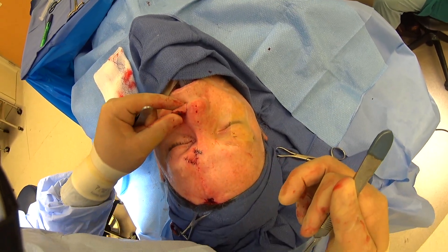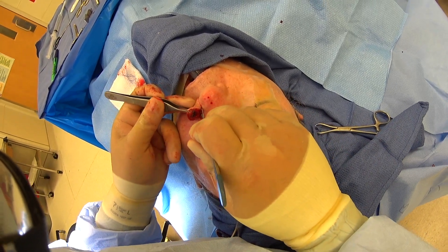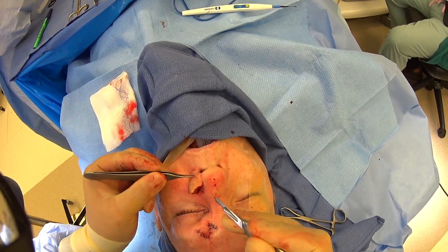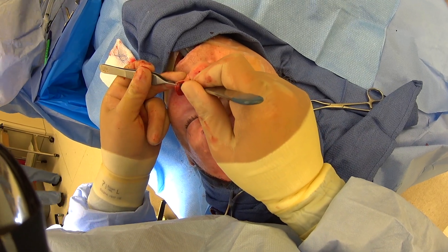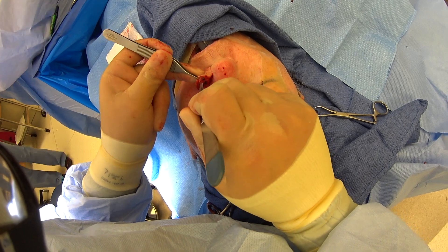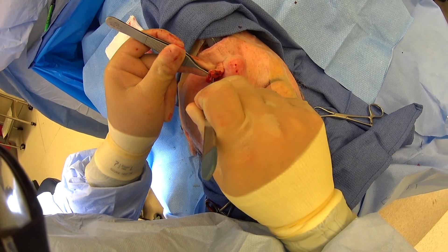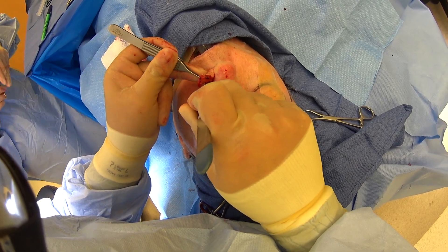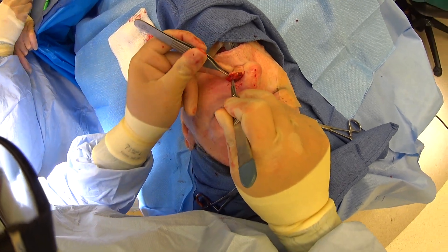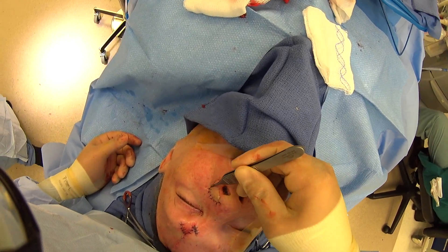Now we're going to finish our contouring here. We'll free up some of this — getting our blood supply from down below, so we have to be careful about how much we free up. We've thinned out the most distal portion; now we're going to thin out this more cranial portion. You can see this is the muscle we're going to take off — basically taking everything off except down to the level of the actual fat. We'll meticulously go through here and free up our edge underneath where we're going to inset it.